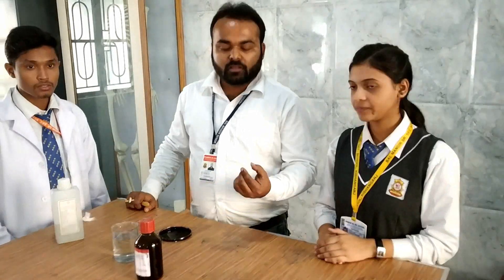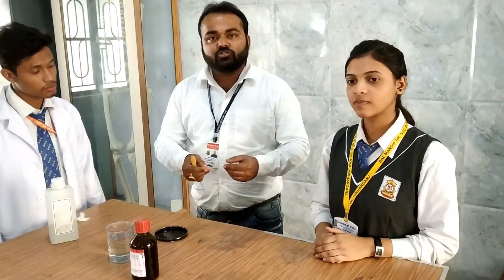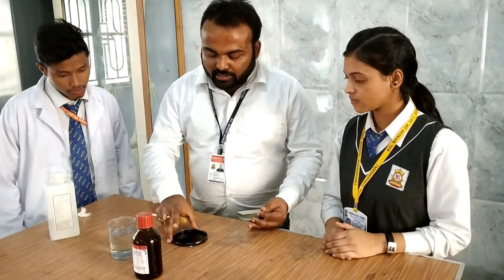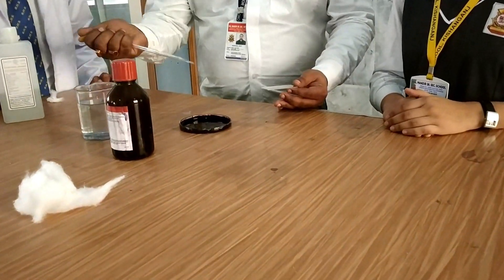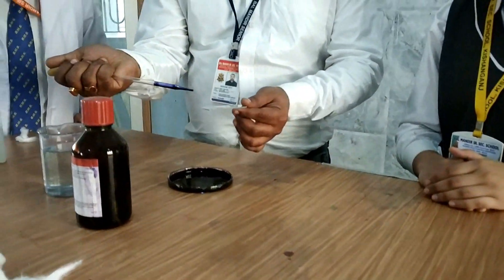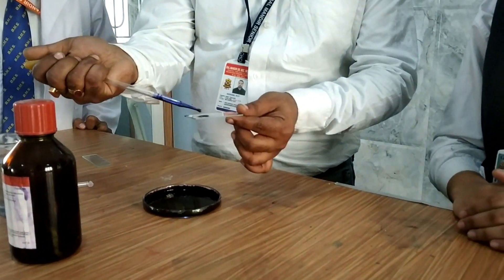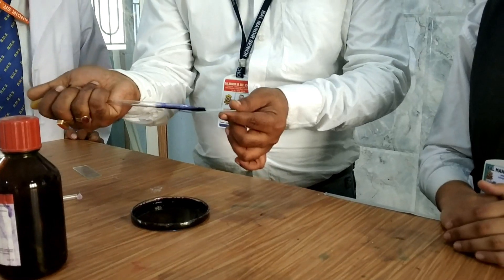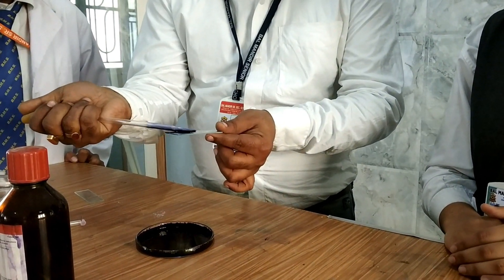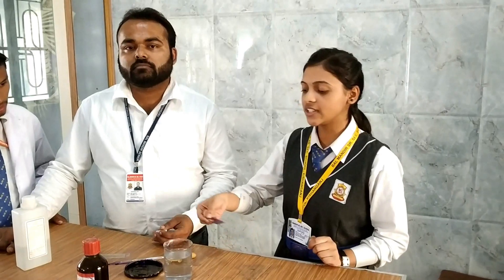After preparing the smear we have to use a stain. The stain is called Leishman stain. We need to take a very little drop of stain and then gently apply that stain on the slide. After applying the stain we will wait for about 50 to 60 seconds and then we will dip it in the water.